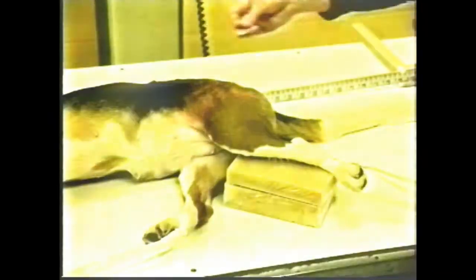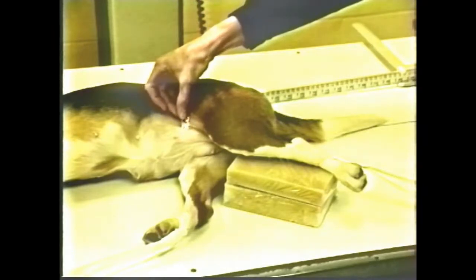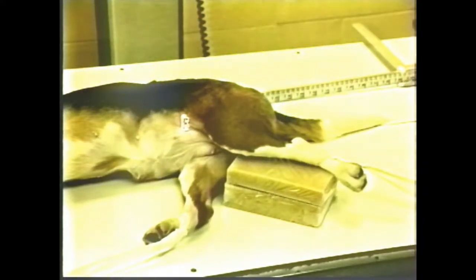The beam must extend dorsal and down to about mid-femur. The animal is measured in order to set the technique. The radiograph is marked by indicating the down or forward leg.